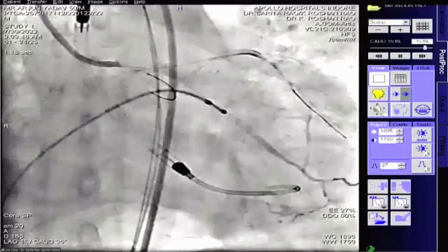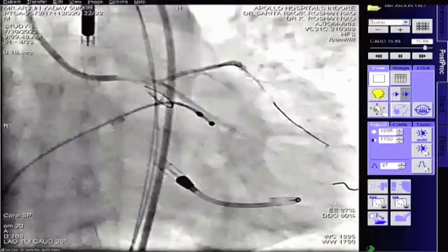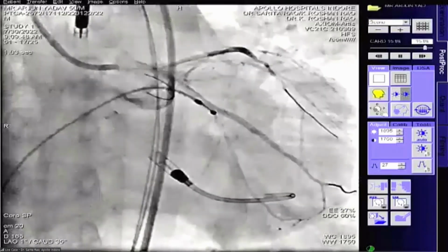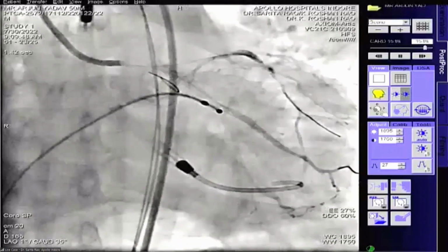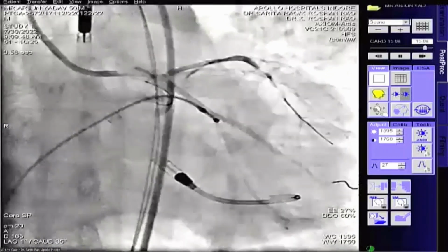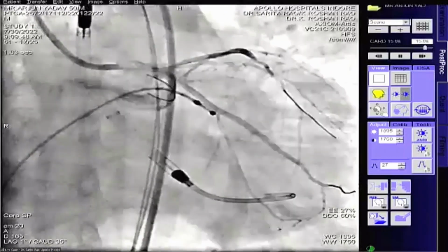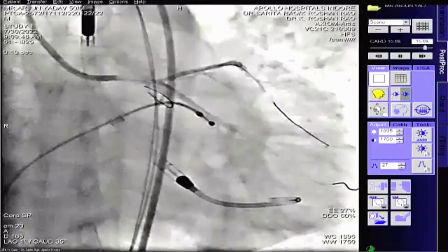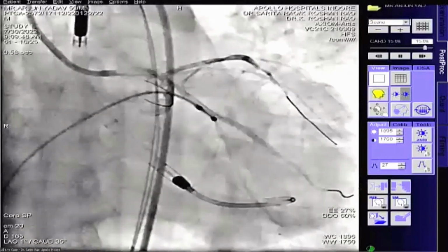Sorry, it wasn't the vessel size was 4.0, right? No, the vessel size was 3. No, the left main is much roomier. No, so at LAD ostium, it was 3.2. Yes, the vessel size was 3.2 at LAD ostium. So you can take a 3.5, I guess.